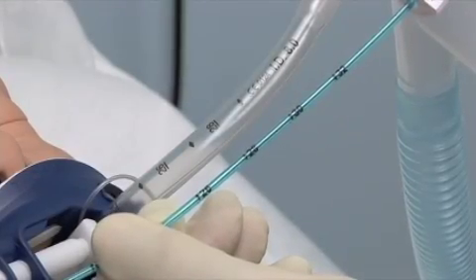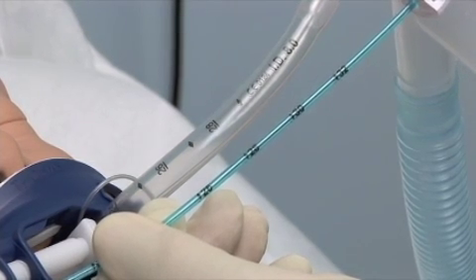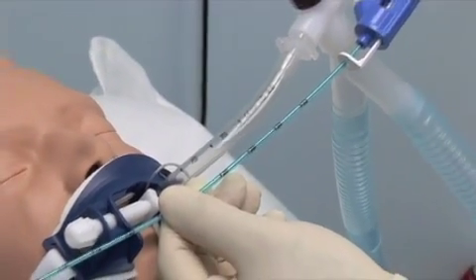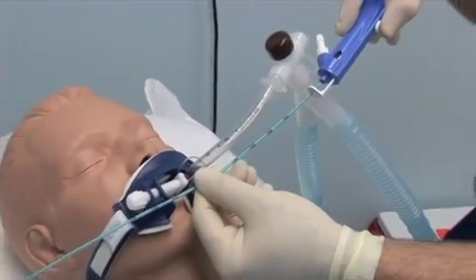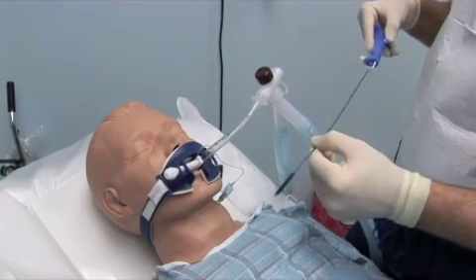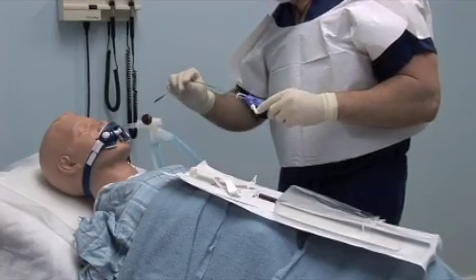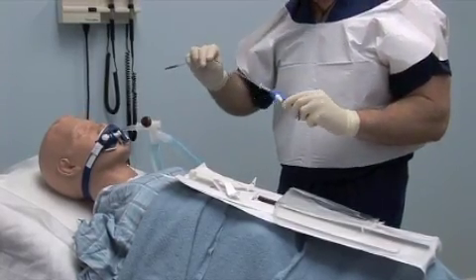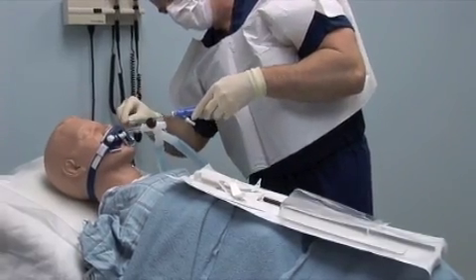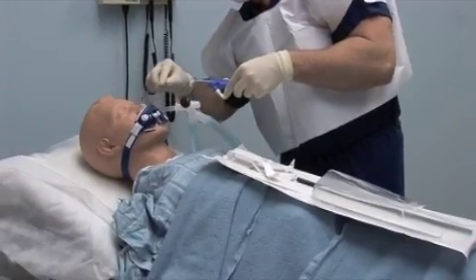Hold the CAM Rescue Cath next to the patient's endotracheal tube, taking care to not contact the patient or any item with the sterile catheter tip. Align the numbered markers on the CAM Rescue Cath with the corresponding numbers on the endotracheal tube. Depress and advance the depth calibrator tab until the depth calibrator disc abuts the top of the endotracheal tube. Make note of this calibrated position, which marks the proper insertion depth for the CAM Rescue Cath.